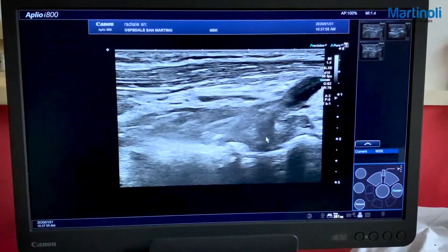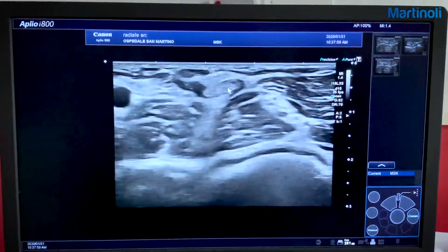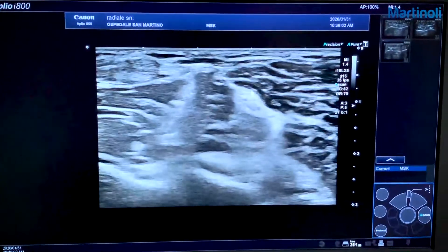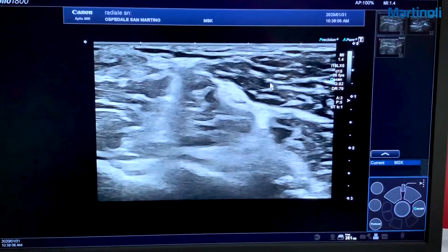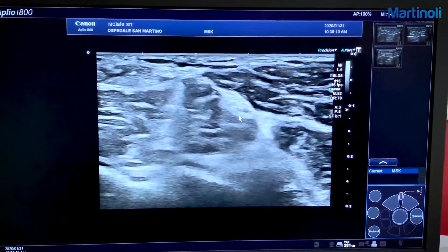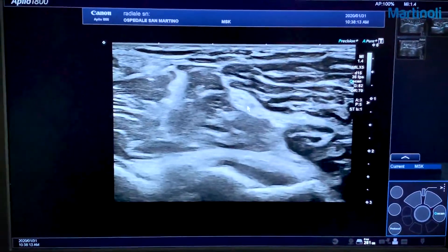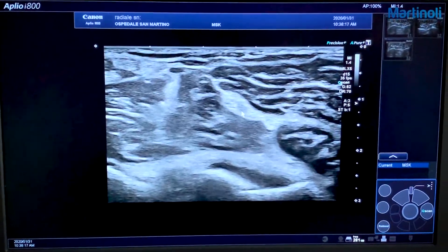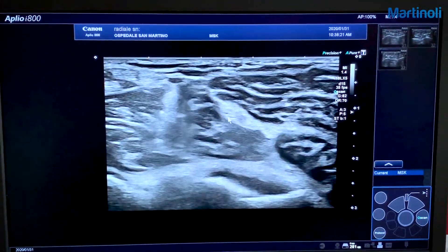When we check the radial nerve, we identify it here in between the brachioradialis and the lateral edge of the brachialis muscle. We see the radial nerve made of two groups of fascicles: the lateral one is the origin of the posterior interosseous nerve, and the medial one is the sensory branch.